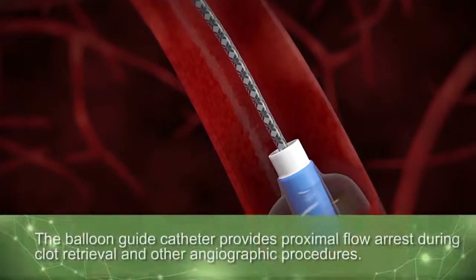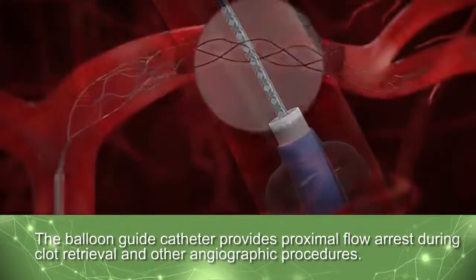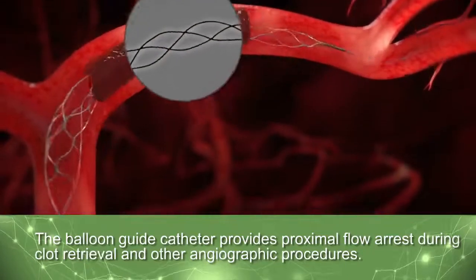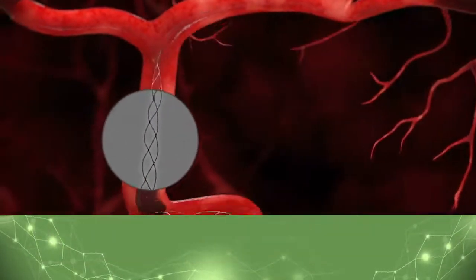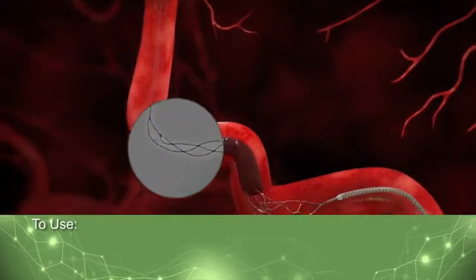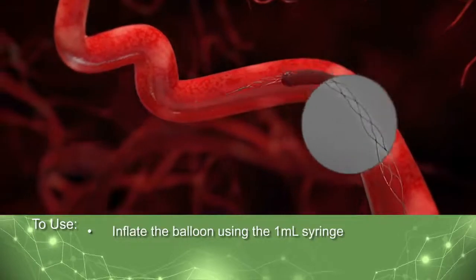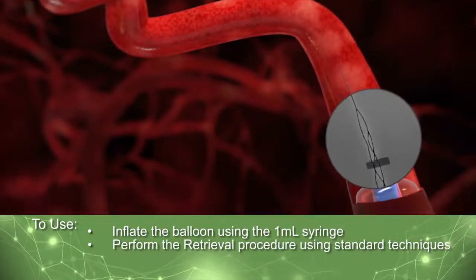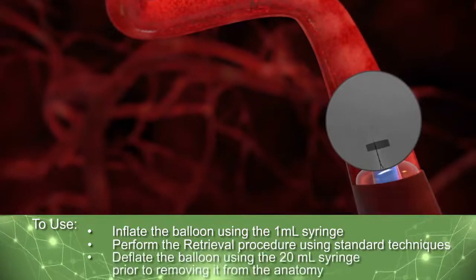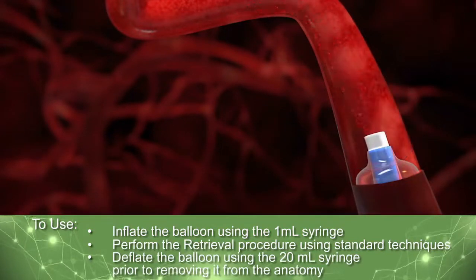The Balloon Guide catheter provides proximal flow control during clot retrieval and other angiographic procedures. Use of the Balloon Guide catheter is similar to prep. Inflate the balloon using the 1-milliliter syringe. Perform the retrieval procedure using standard techniques. Deflate the balloon using the 20-milliliter syringe prior to removing it from the anatomy.